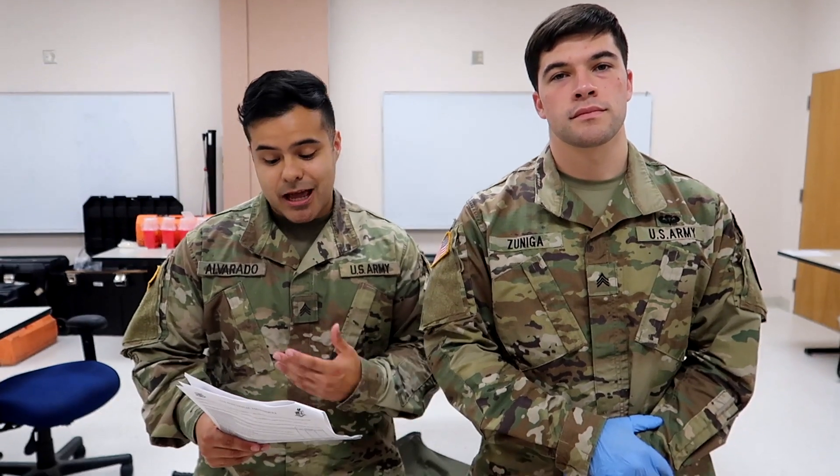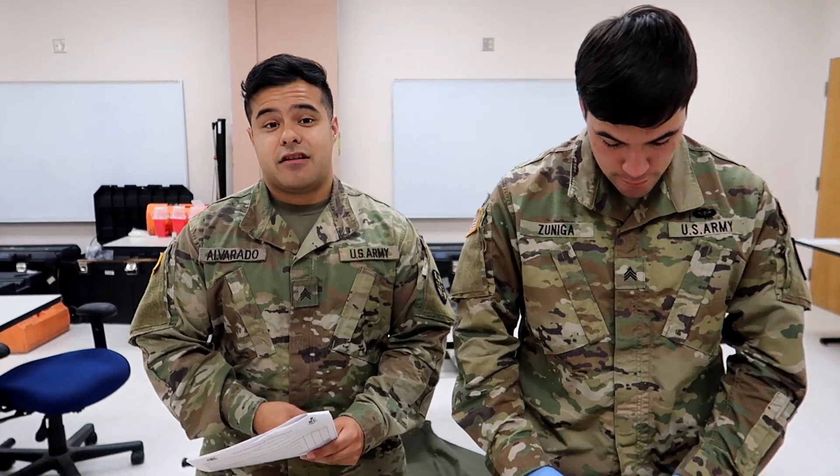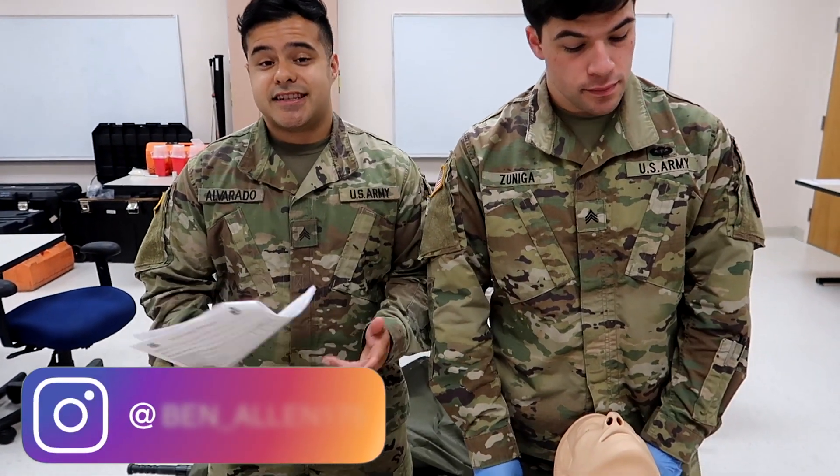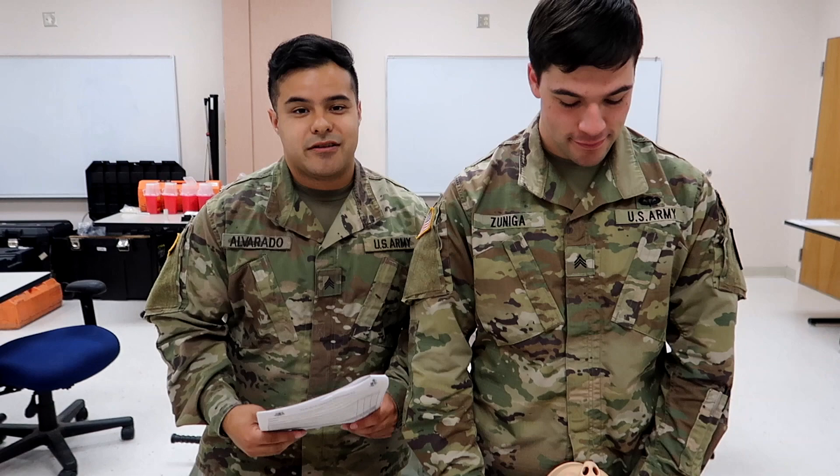What is up guys, Ben Allen back again with another individual skills validation episode. We're going to be going over the surgical cric. This is one of the skills you're going to be tested on for your individual skills validation in 68 Whiskey AIT. So we're going to be going over it with our demonstrator, Sergeant Zuniga.